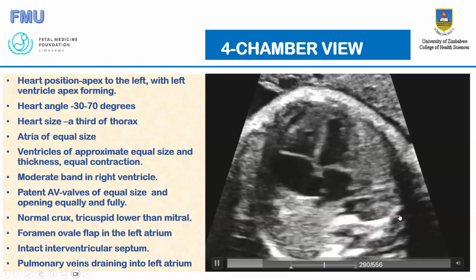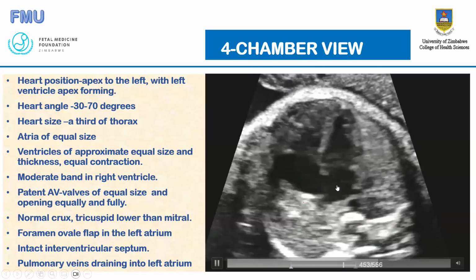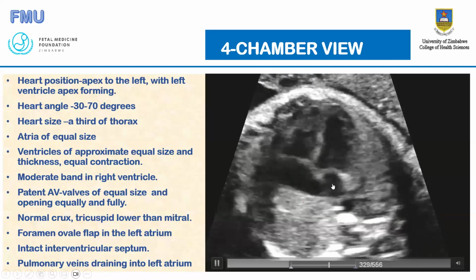Right. Then let's play it. So we can see here that there's a small flap which is denting on the left side of the heart.